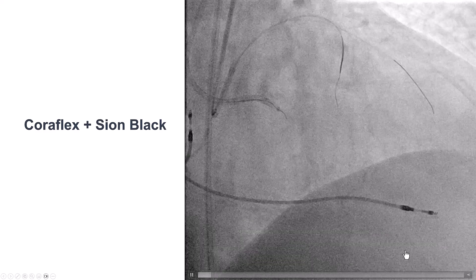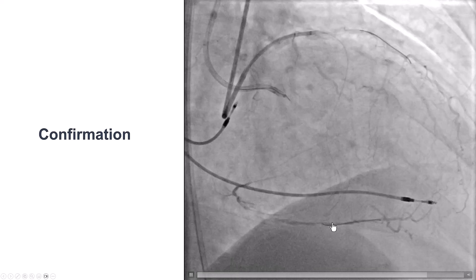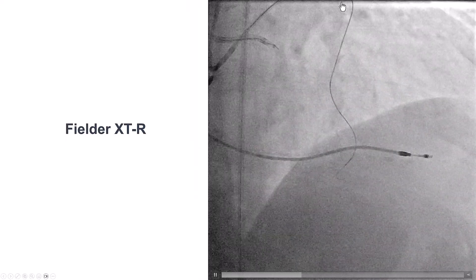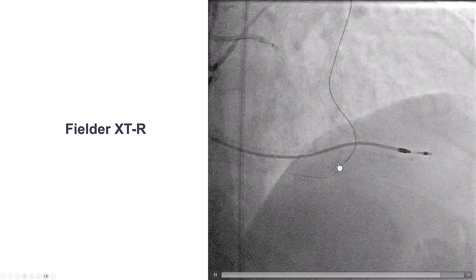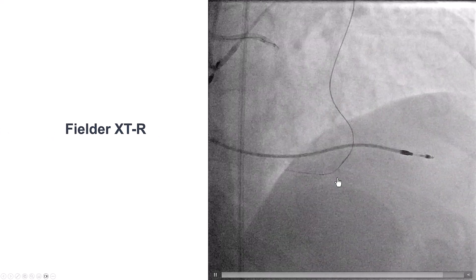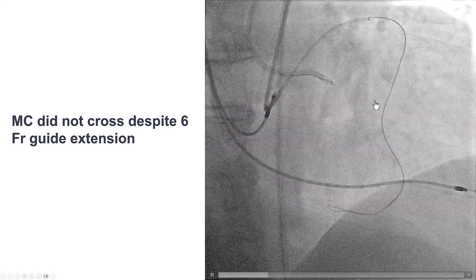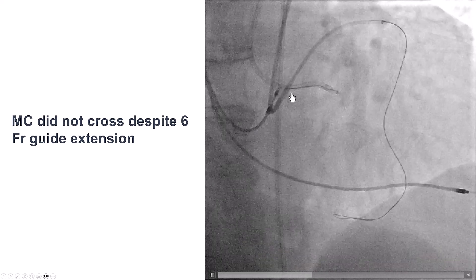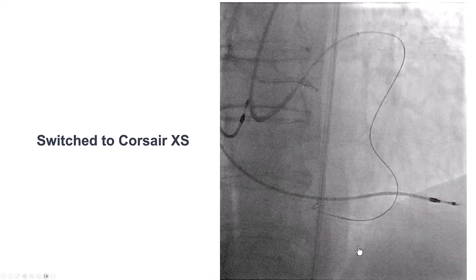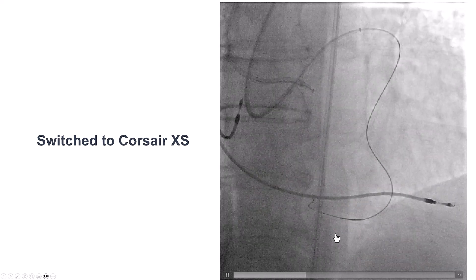Unfortunately, the wire went towards the apex instead of the base. We confirmed we were in the true lumen — we were in the PDA, however going in the wrong direction. To deal with this, we advanced the microcatheter as far down as we could and then switched the wire. We took a Fielder XTR guide wire with a larger bend and were able to advance it retrogradely towards the distal RCA. The problem was that we could not get the microcatheter to cross. We used a guide extension but it still would not cross, and so we eventually switched to a Corsair XS microcatheter, which finally successfully crossed into the right PDA.